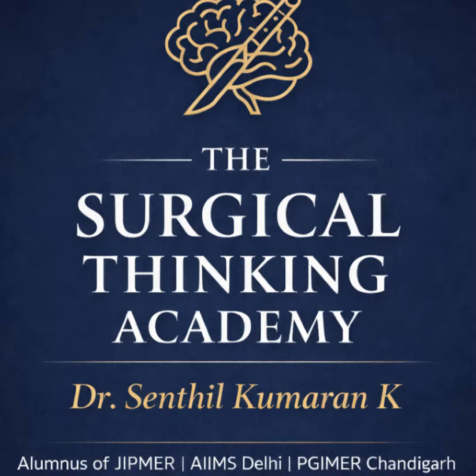Okay. Scenario B. Patient had stage 3 colon cancer 5 years ago. Now, on a routine follow-up, their liver enzymes are a bit bumpy. CT shows 3 hypodense lesions with rim enhancement. Metastatic disease. The history of colon cancer plus multiple lesions plus that halo look makes metastasis the primary driver. You check the CEA to confirm, but the imaging is already telling the story.